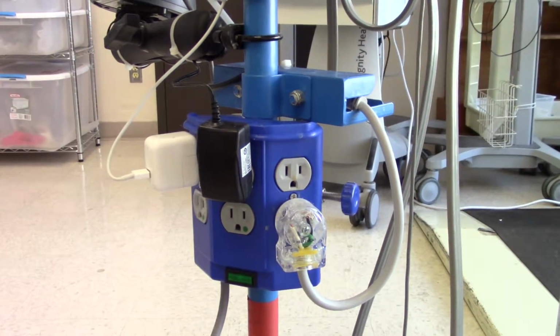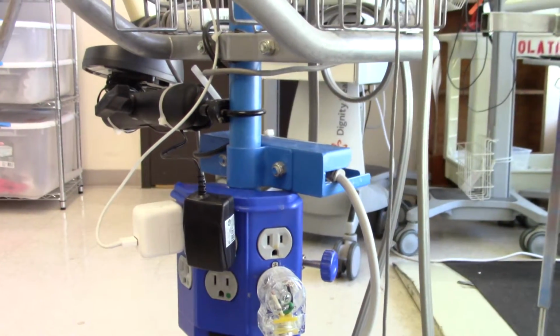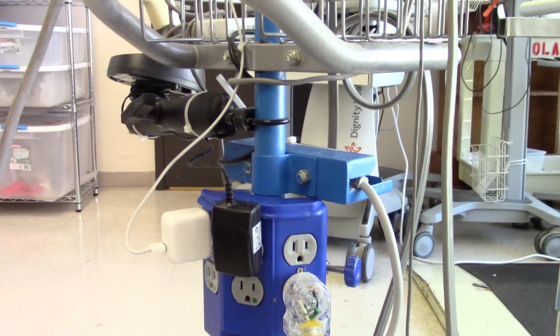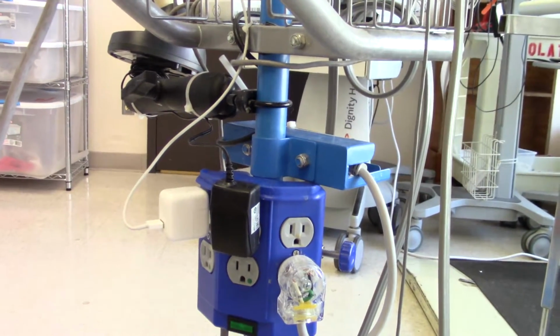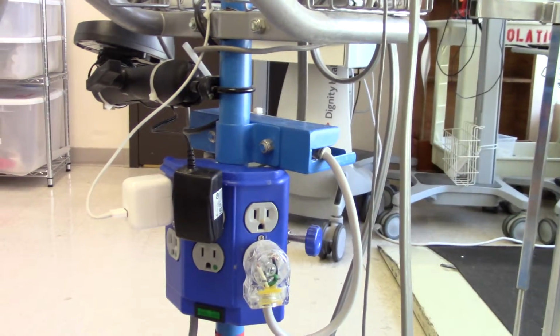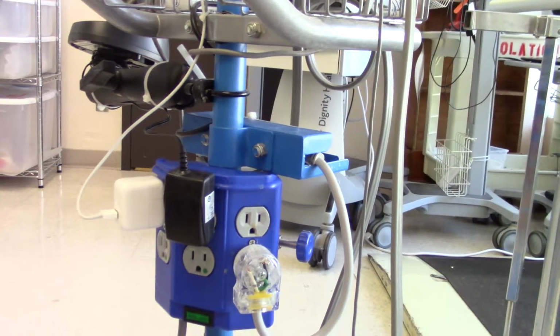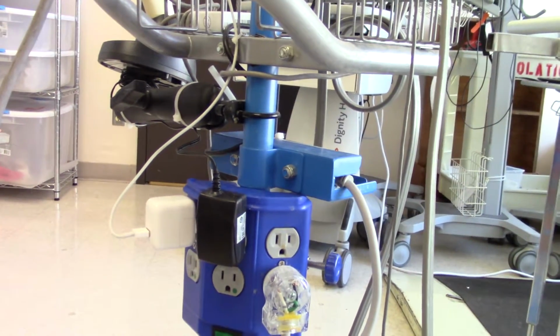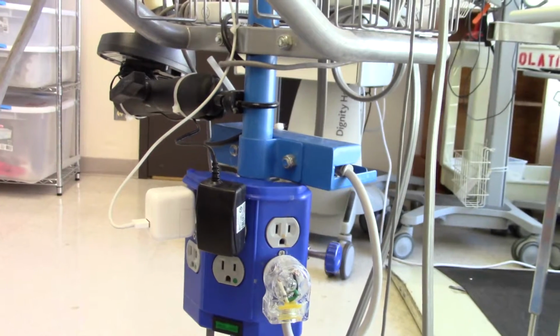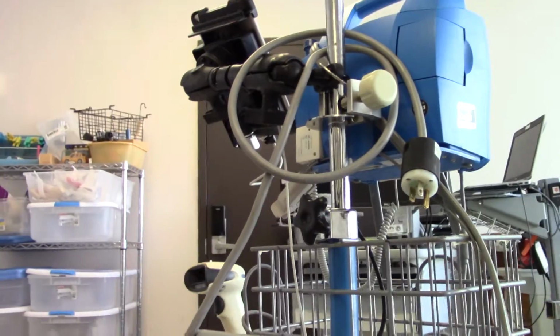Okay, so the GE either has this blue power harness, or if it's the Welch Allyn, it has that. And those are the two power harnesses you're using. Correct. The power harnesses are fine. Really, the problem is that these cords are sticking out at an angle, so they can get damaged. And people steal the bricks sometimes to do recharging. Other than that, the arm on the GE is okay, so that's not a big problem. The Dinamaps we don't have as much of an issue with, just because it's a little bit more rigid mount.